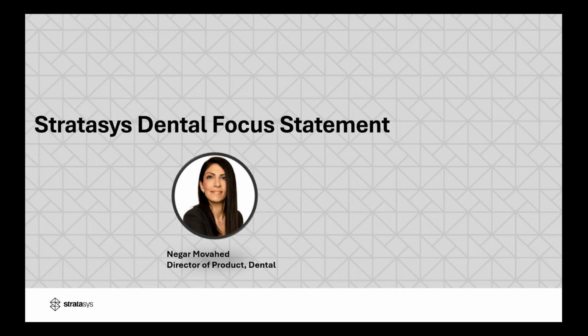Some of you that have been on this journey with us remember that when we launched TrueDent a few years ago, we set a new standard in the industry for the first polychromatic monolithic digital denture, which really put us on the map for the best aesthetics on the market. Today, we're really proud to say that TrueVoxel builds on that foundation, and it allows our customers to unlock a lot more value from their J5 platforms and the TrueDent solution. At the same time, it sets us up for even greater performance in the future, which I'm going to talk about in a few seconds.